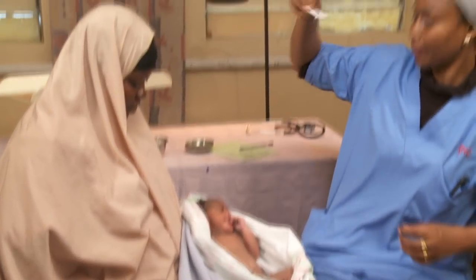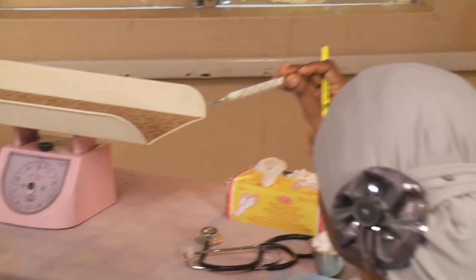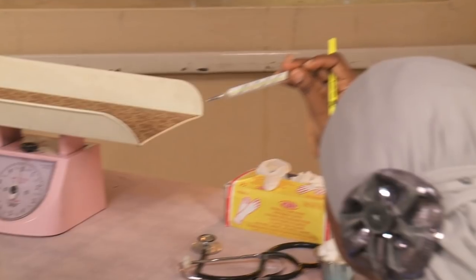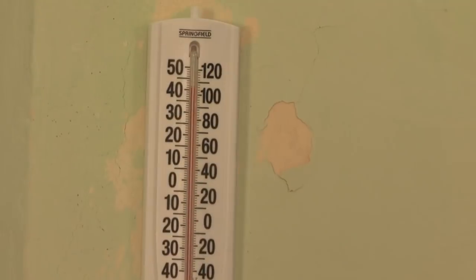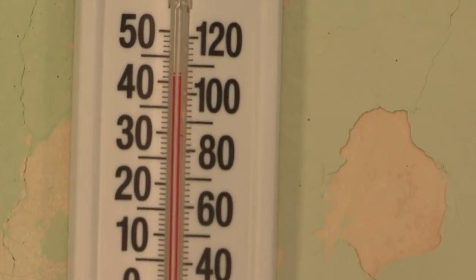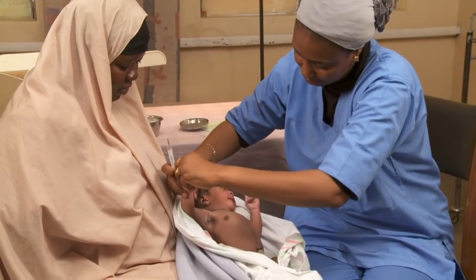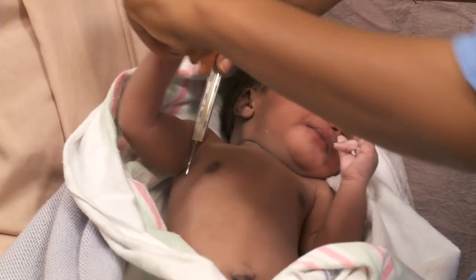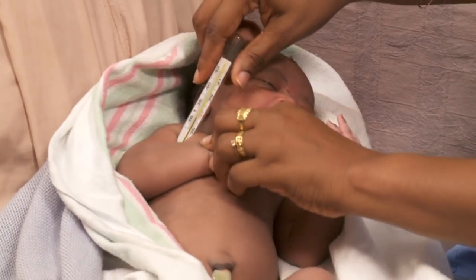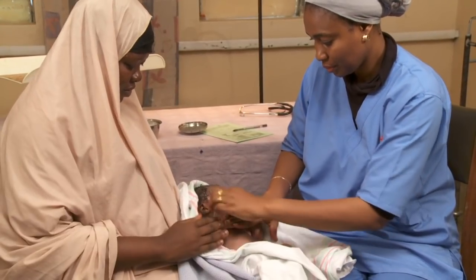To take the temperature using a thermometer, shake it down and read it to be sure it's below 35 degrees centigrade. In very hot regions, the thermometer will read higher than a fever if you forget to shake it down. Place it deep under the arm and hold the baby's arm against his body. Wait three minutes.